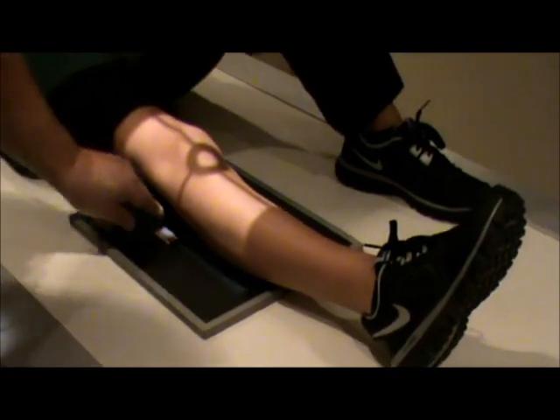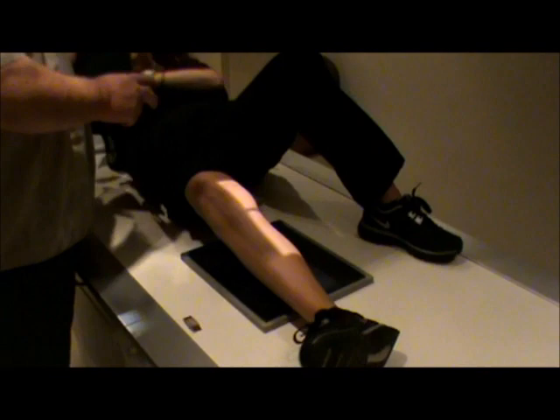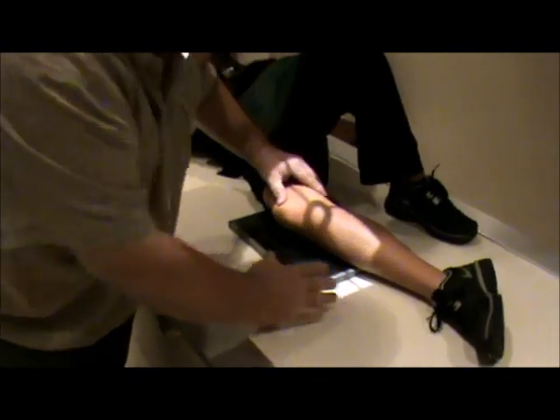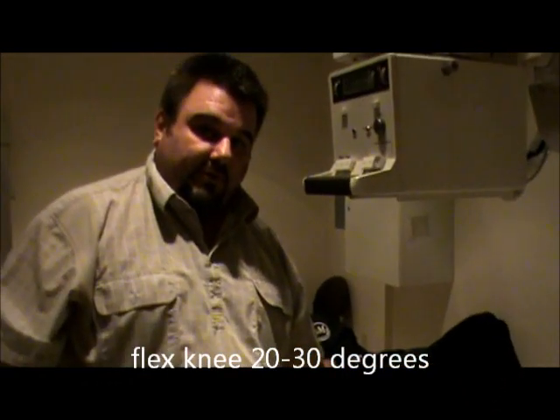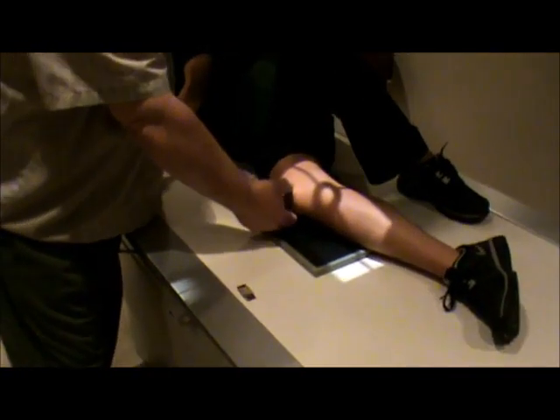Now we're going to do our lateral. We're going to have the patient roll up onto their affected side, adjusting the shield. We're going to have the patient flex the knee 20 to 30 degrees. We don't want to flex it more than 20 to 30 degrees because if we do, the patella will actually go back into the intercondylar fossa and we can't see a good joint space there.